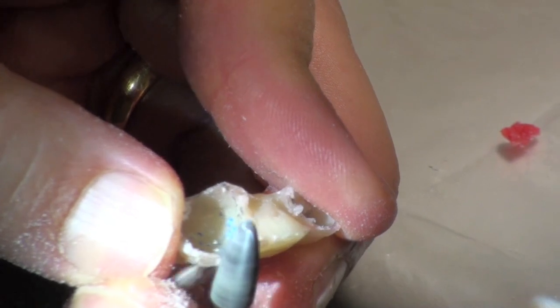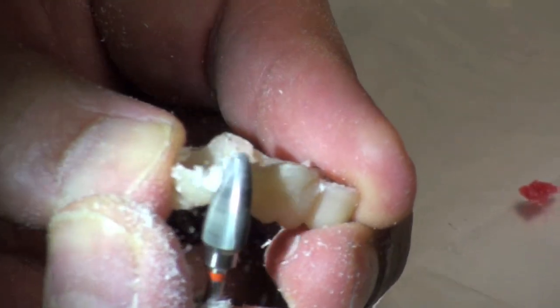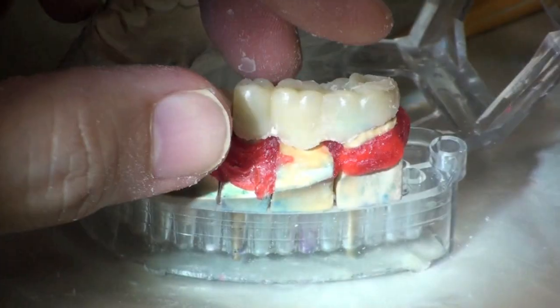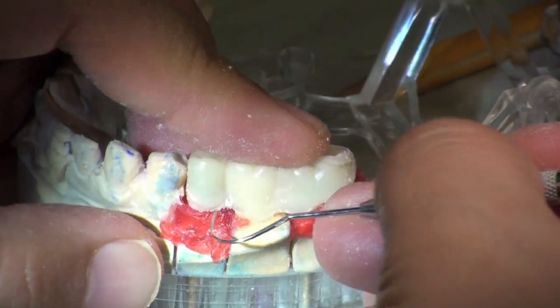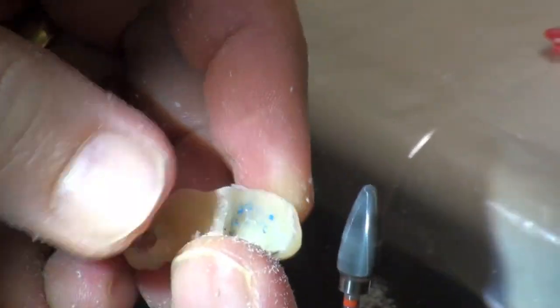Let's trim the outside back a bit more. Smoothing the outside as well as the margin. Let's blow it off and check it again. There we are — there's my margin. Down, down, down it goes — that's just about right. That's perfect right there. That was a little overextended, but not bad. And on the inside, we're looking better. So you can just do that: check it in the mouth, check it on the internal surface, see where you're at until you get the margins where you want them to be.